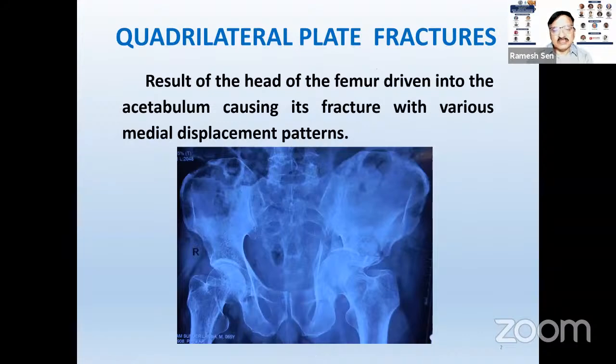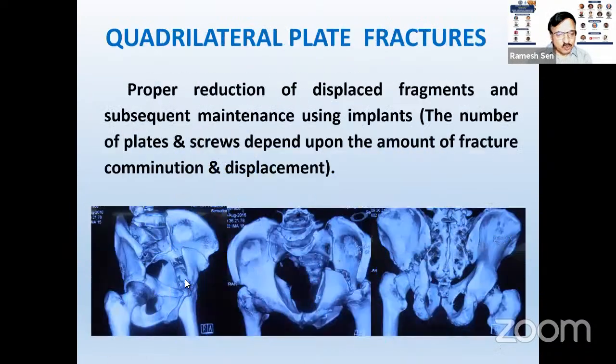When we look at these fractures, if we look at the area of the fracture, you do see that the femur head has actually impacted inside. And this is a very important perception, because here, if you look at the fragment, one goes up, one goes medially, and the head is trying to come in between the two fragments, between the fragment which has been pushed up and the fragment which has been pushed medially.